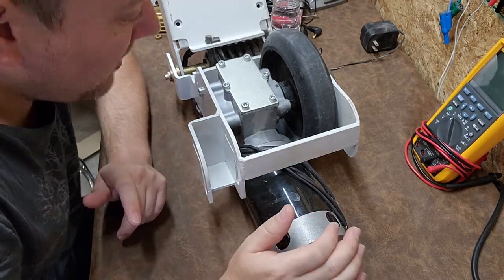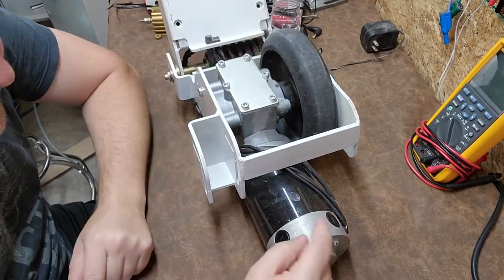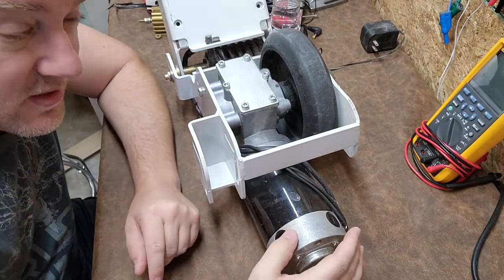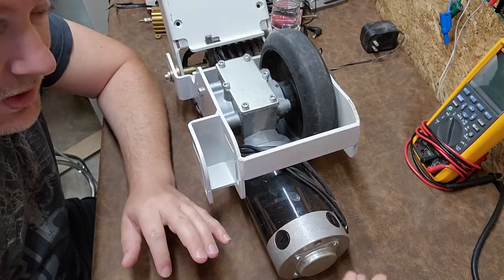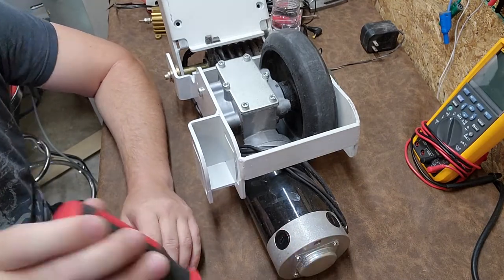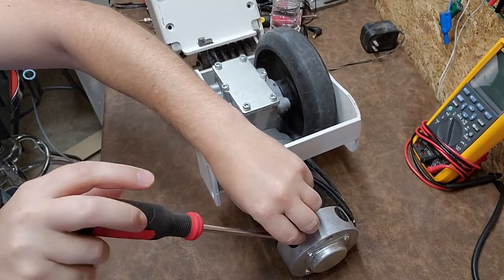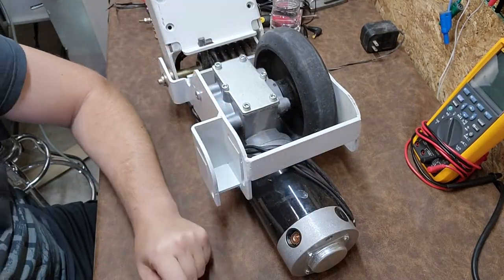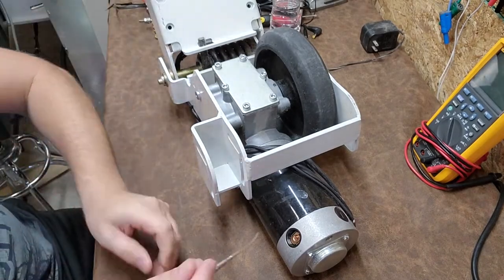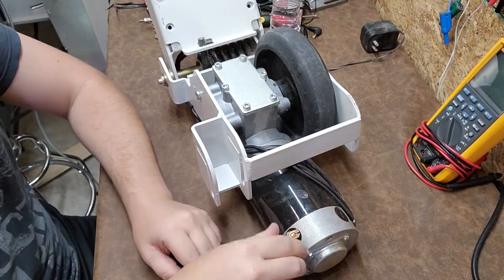This is a drive motor from a stretcher. You can tell based on these little caps around the perimeter that this is a four-pole motor, so there are going to be two separate coils in here. They have brushes, and these tiny little brushes are underneath the covers. To get to them we just pop these guys out.